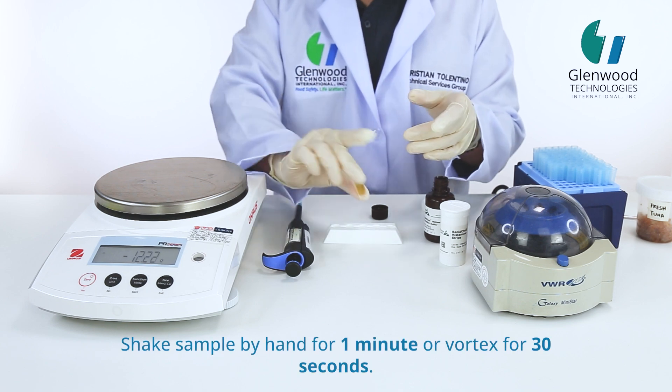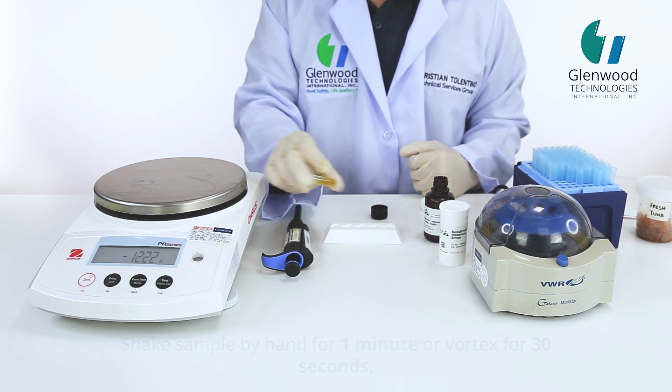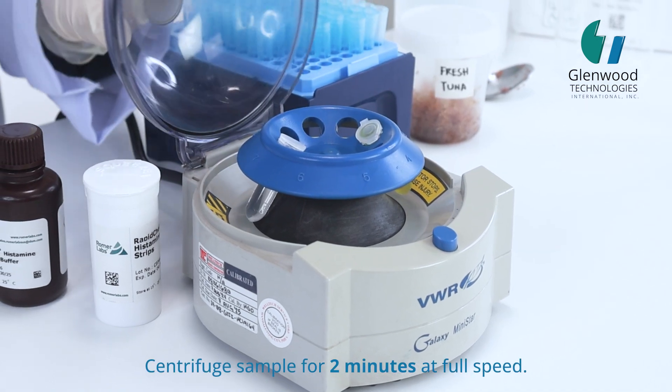Shake sample by hand for 1 minute, or vortex for 30 seconds. Centrifuge sample for 2 minutes at full speed.